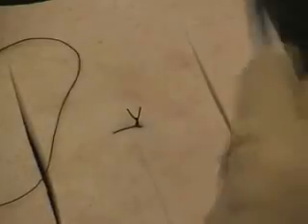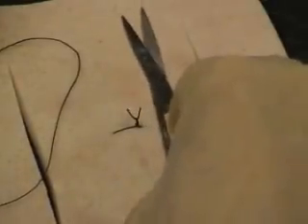That's the only technique that you need to worry about with the scissors: hold it correctly, slide down, only open as much as what you need. Try to cut with the tips. In other words, you don't want to be cutting something right in here. You want to really just be cutting with the tips and only cut what you can see. If you're in an OR setting and you're very deep down, you could inadvertently get in too far and be cutting something distal. So tips is best. Even in the ER setting, it's a good rule of thumb just for good technique.